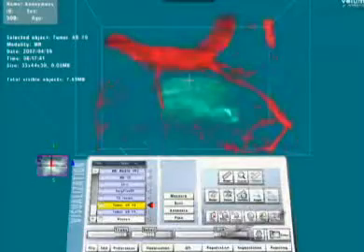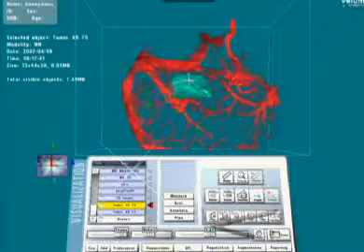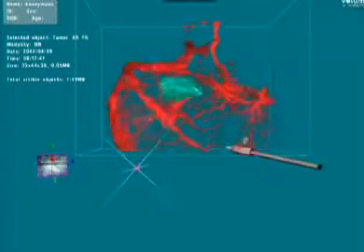and all confirmed intraoperatively. Postoperative MRI then on this patient immediately in the 24-hour period afterwards demonstrated a complete resection of this tumor, and the patient actually was discharged home the next day with no neurological deficit.